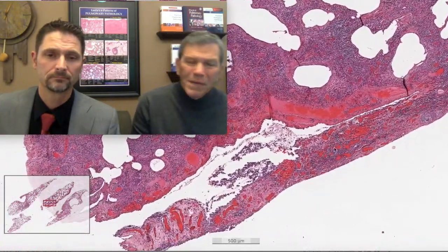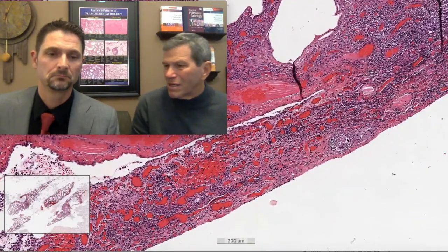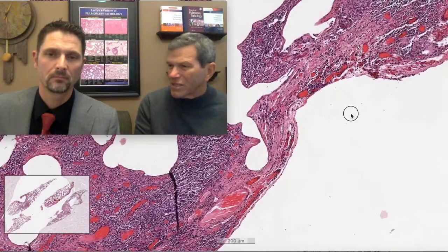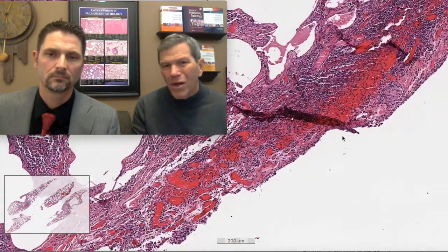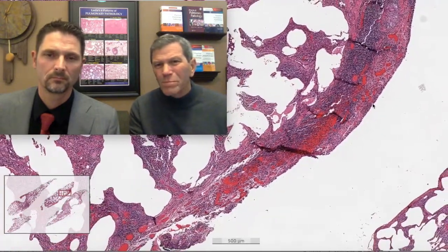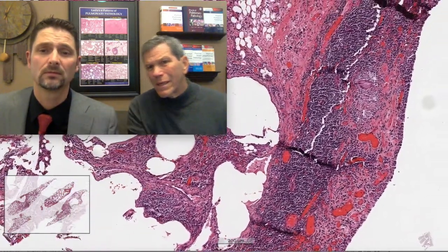You know, we talk about it being an alveolitis, but hypersensitivity in its cellular phase, in the subacute phase, tends to be a slightly pinker disease, meaning there are plasma cells, but there aren't this many lymphocytes in aggregation. And that's a lot of lymphocytic pleuritis. Look at that pleuritis, with a granuloma in it. Okay. Yeah, wow. So some people would call this LIP.